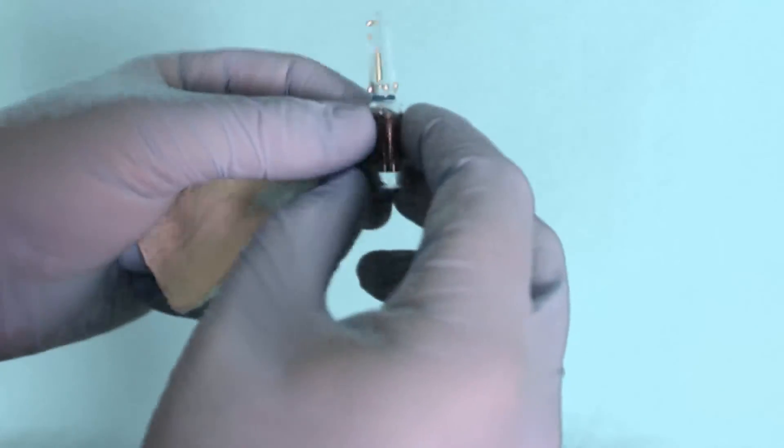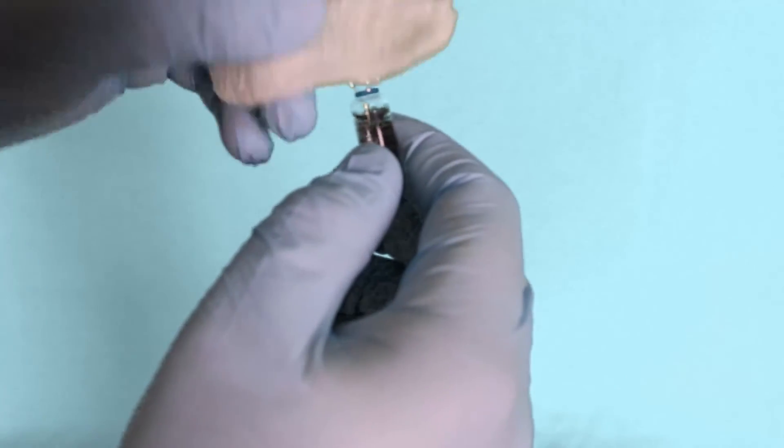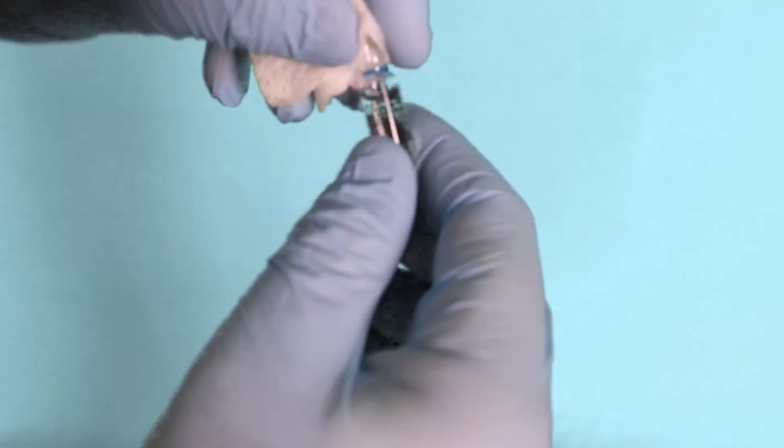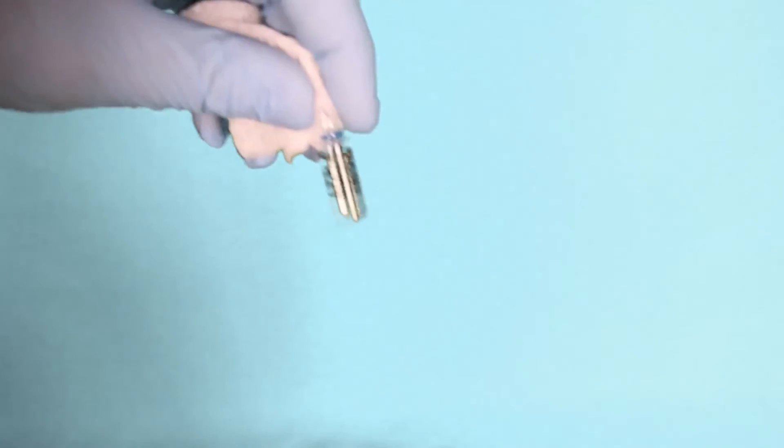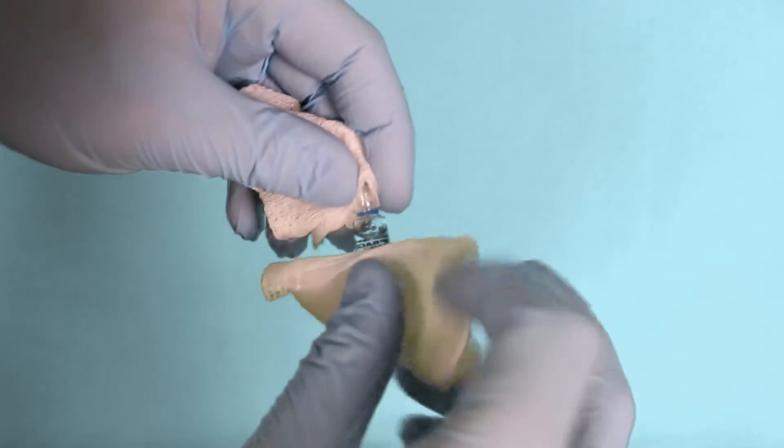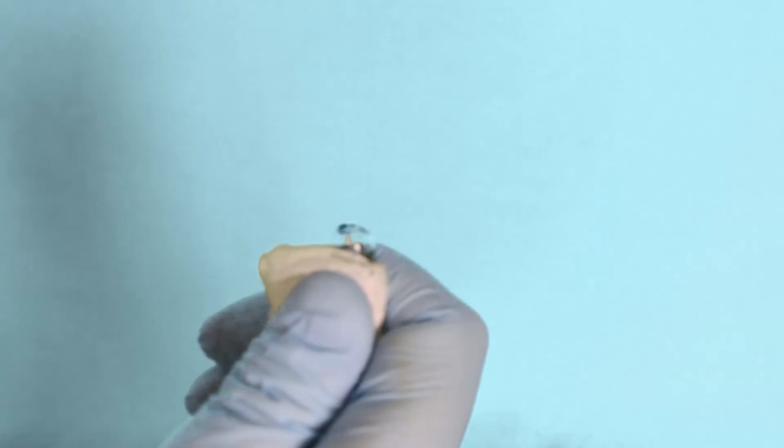To do this we have to break open a sealed glass ampoule. A good technique is to wrap one piece of gauze around the narrow part of the ampoule and another piece around the fat part of the ampoule. Holding the ampoule upright, snap the ampoule open by pushing the top away from us.